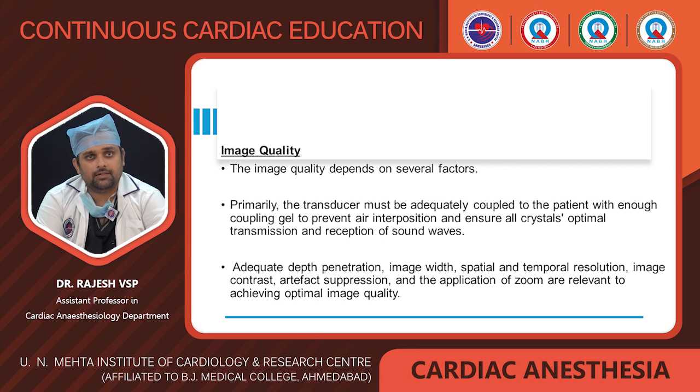Coming to the image quality. The image quality depends on several factors. Primarily, the transducer must be adequately coupled to the patient with enough coupling gel to prevent air interposition and ensure all crystals have optimal transmission and reception of sound waves. Adequate depth penetration, image width, spatial and temporal resolution, image contrast, artifact suppression, and the application of zoom are relevant to achieving optimal image quality.